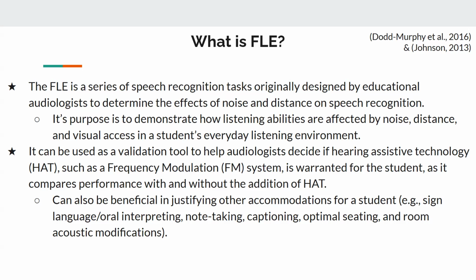The FLE can be used as a validation tool to help audiologists decide if hearing assistive technology, such as frequency modulation or FM systems, are warranted for the student, as it compares performance with and without the addition of hearing assistive technology. The FLE can also be beneficial in justifying other accommodations for the student, such as sign language or oral interpreting, note taking, captioning, optimal seating, and room acoustic modifications.